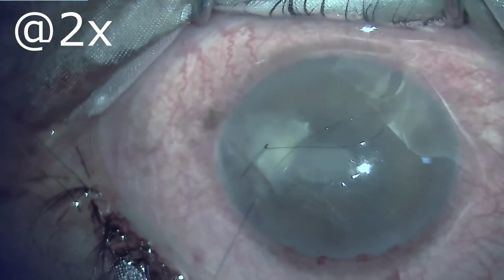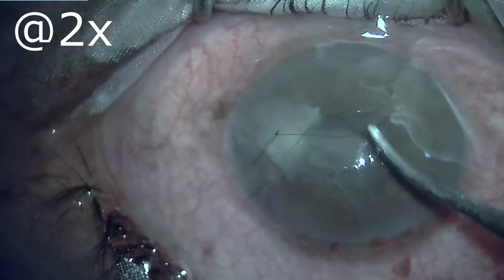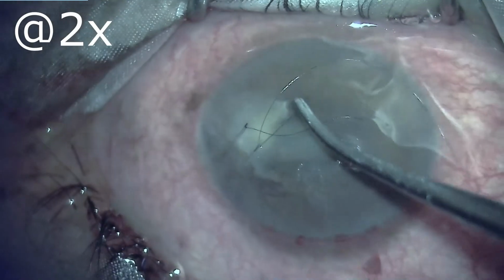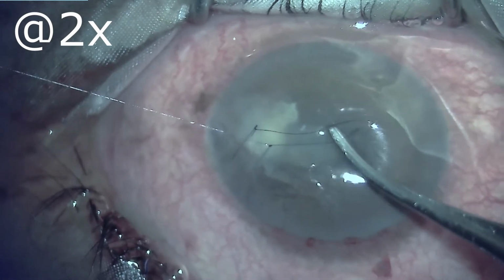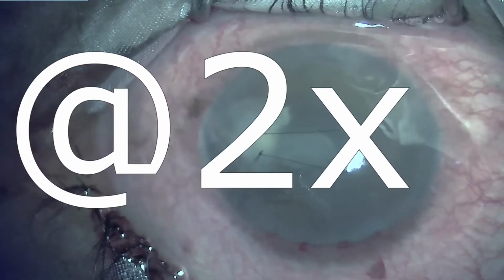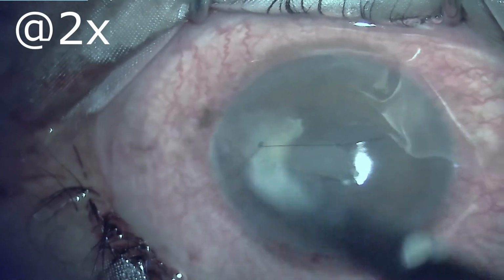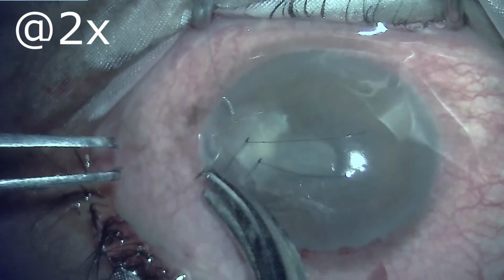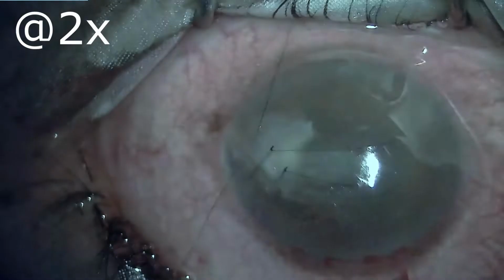This laceration is very small, so just putting up three sutures will serve the purpose. As we can see, the knots and sutures are being taken up so as to form a square if the subsequent and adjacent sutures are connected together. This is how a corneal repair should be done, forming a hypothetical square if we connect the sutures. Now this is the final suture.